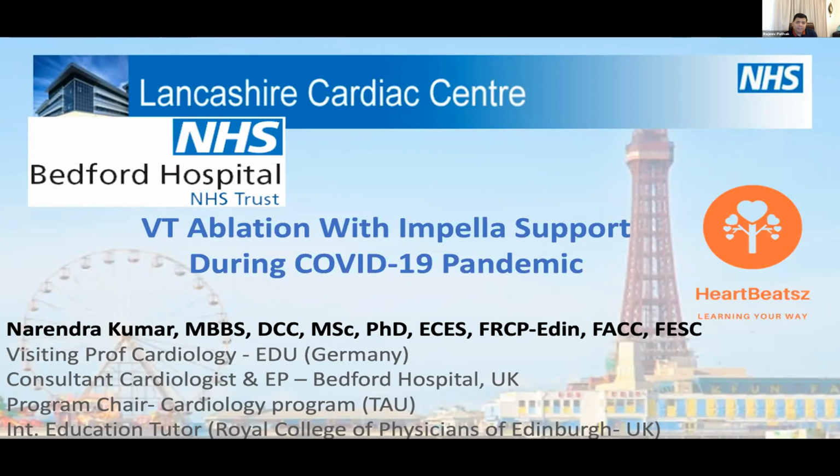There's a new needle catheter with a perforator, developed by the Biosense Webster group. Professor Bill Stevenson is the person who has used it. I haven't personally used that catheter, but it's on the horizon. All of these extreme measures come with their own risk of complications. So these are the different things which are currently available.